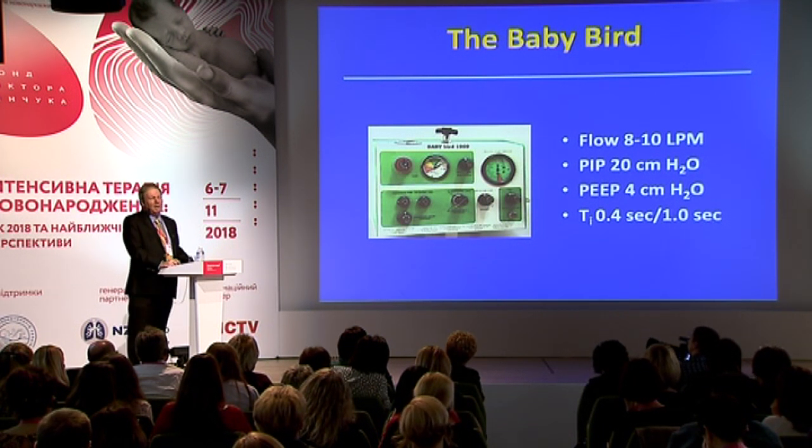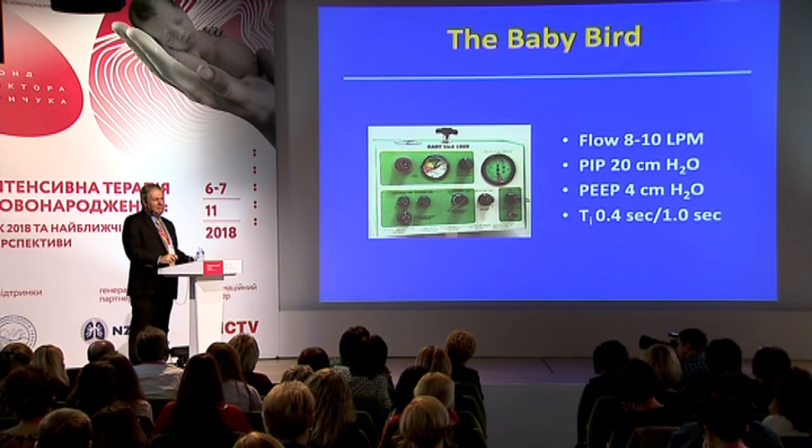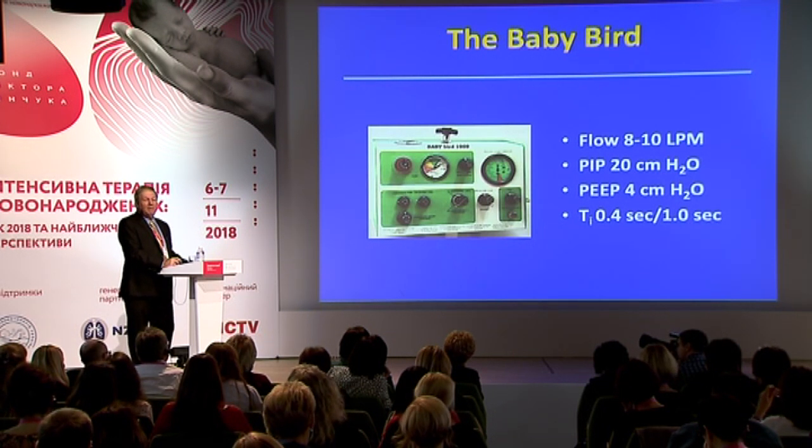And it didn't matter, as I said, what disease the baby had. These were the ventilator settings that were used in almost all cases. And we hoped for the best.